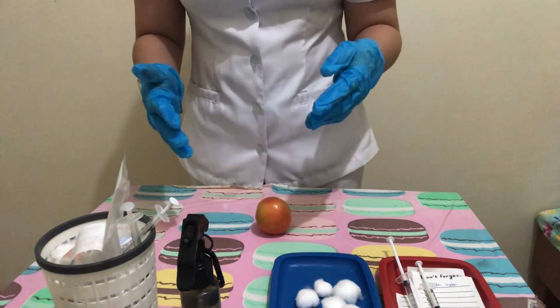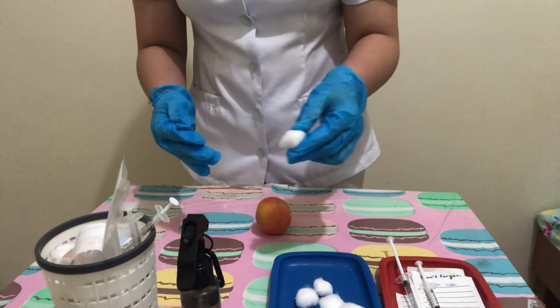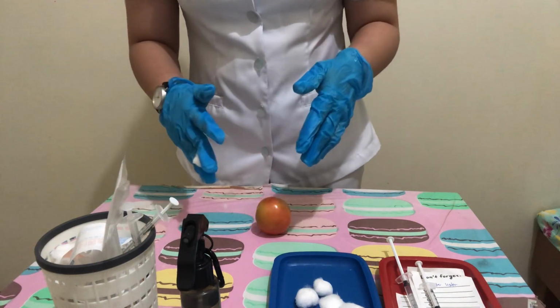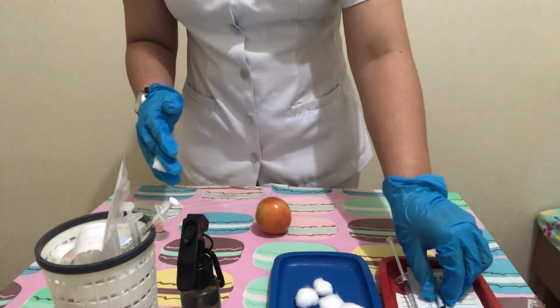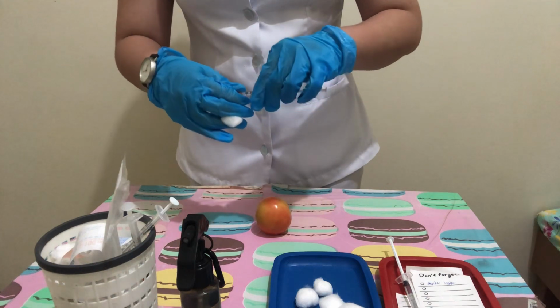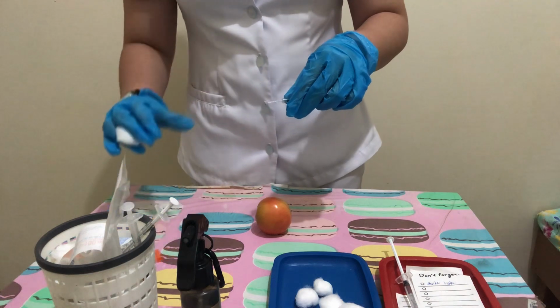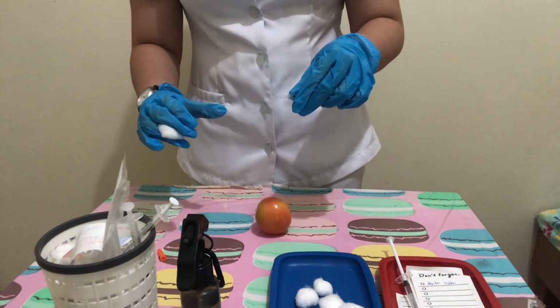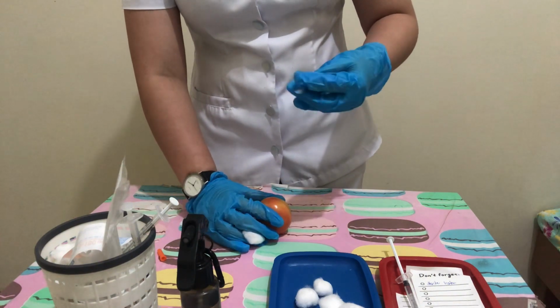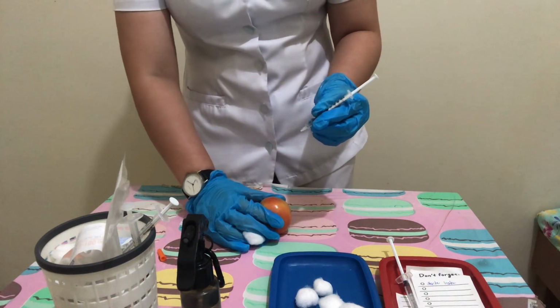And then place and hold the swab between the third and fourth fingers of the non-dominant hand, or position the swab on the client's skin and above the intended site. And now pull the needle cap and hold the syringe in your dominant hand by holding it between your thumb and fingers. So using the non-dominant hand, pinch or spread the skin at the site, and then insert the needle quickly and firmly at a 45 to 90-degree angle using the dominant hand.